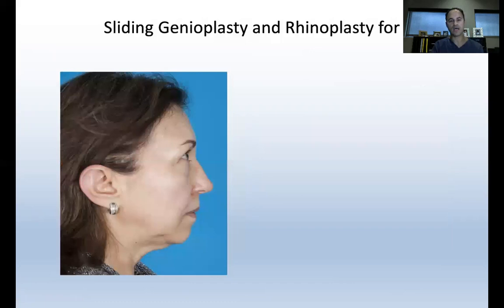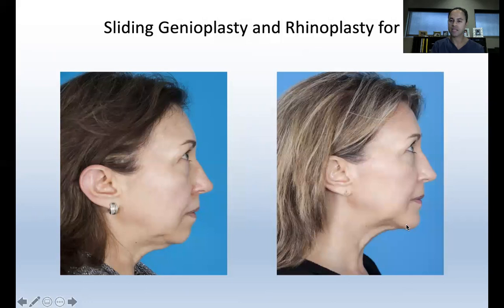This is postoperatively after rhinoplasty and a sliding genioplasty of about 6 millimeters, improving the neckline, improving the airway, and also improving her obstructive sleep apnea. This is a patient, again, with a three-quarter view, with improvement in the jawline and the neck.